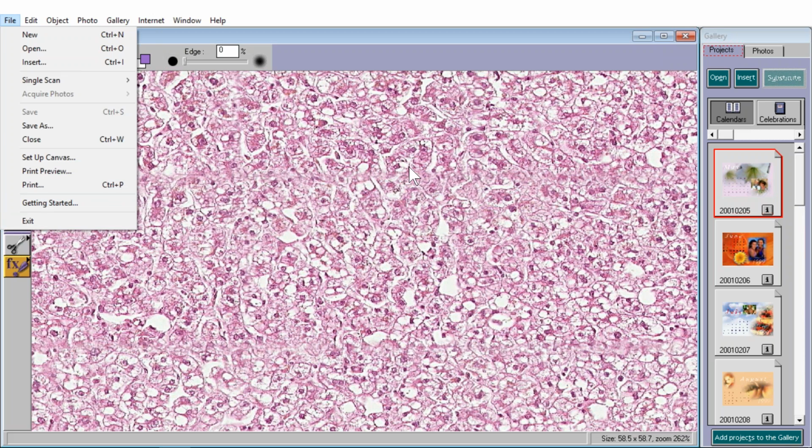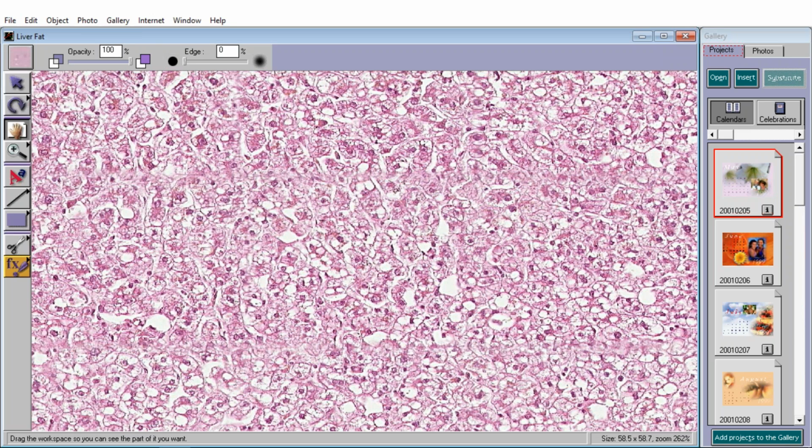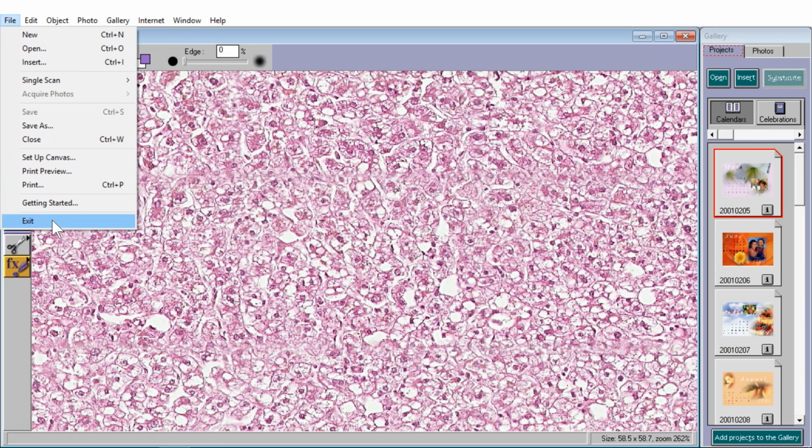Not that it really matters, because fat is fat, but in the early stages, the vacuoles are likely to be smaller and intracellular, and in the later stages, the fat accumulation could be much bigger than the liver cell.